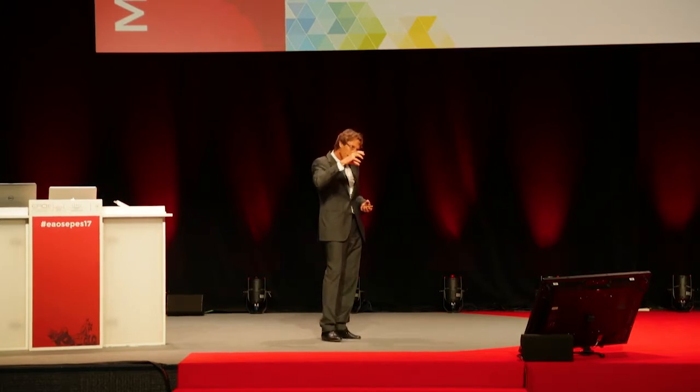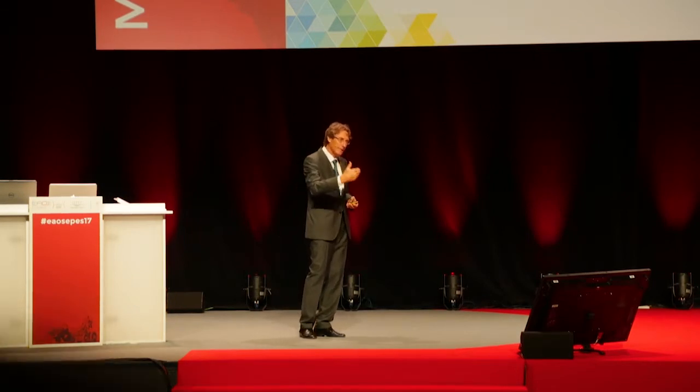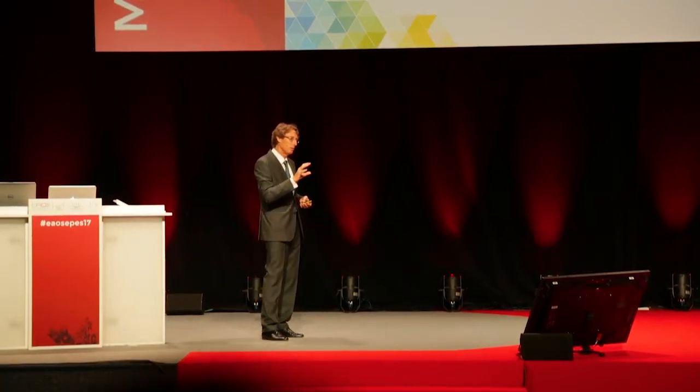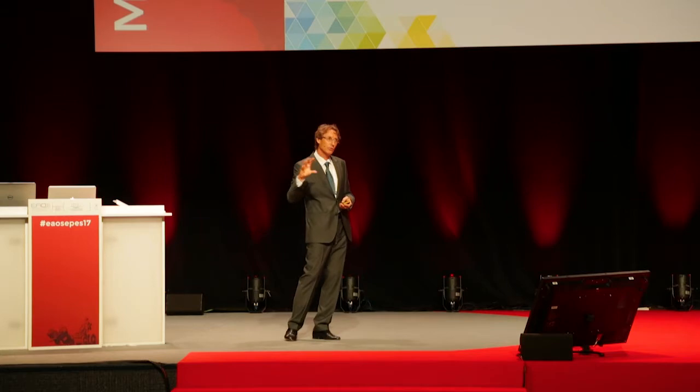PMMA veneers, multi-layer veneers on it. And we saw that now we had in the anterior regions problems of breaking off of the entire veneer. And we didn't have this problem on the injected frameworks. And we learned that with the injected frameworks, with this analog workflow, we can give them another shape than with the machined one. So we thought, okay, how can we solve this problem, and we started to make it like the ceramic to metal fused system.